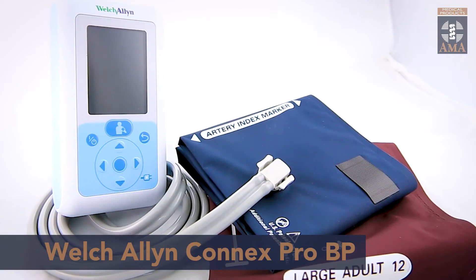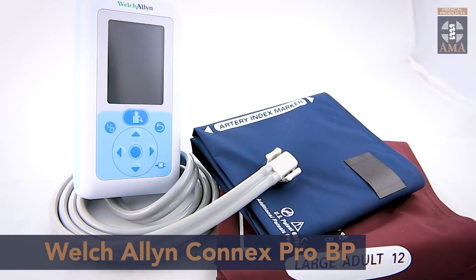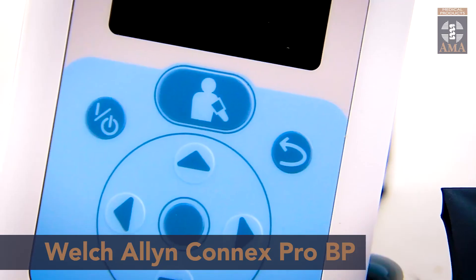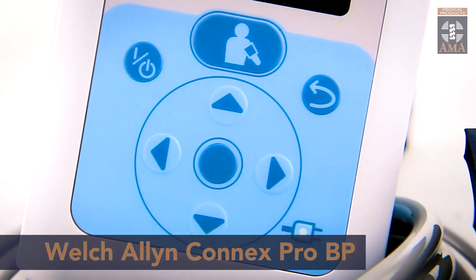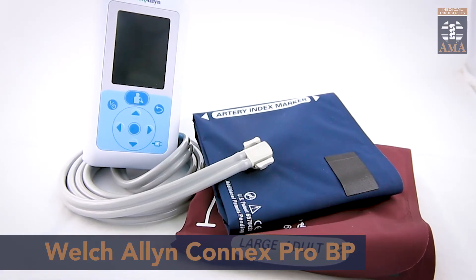It is available in configurations to suit your specific need. It can be used as a handheld device or can be attached to a wall mount, a desk mount or even a rolling stand. Its single button operation makes it very easy to use and it takes readings in 15 seconds or less, making measurement very quick and a very comfortable experience for the patient.